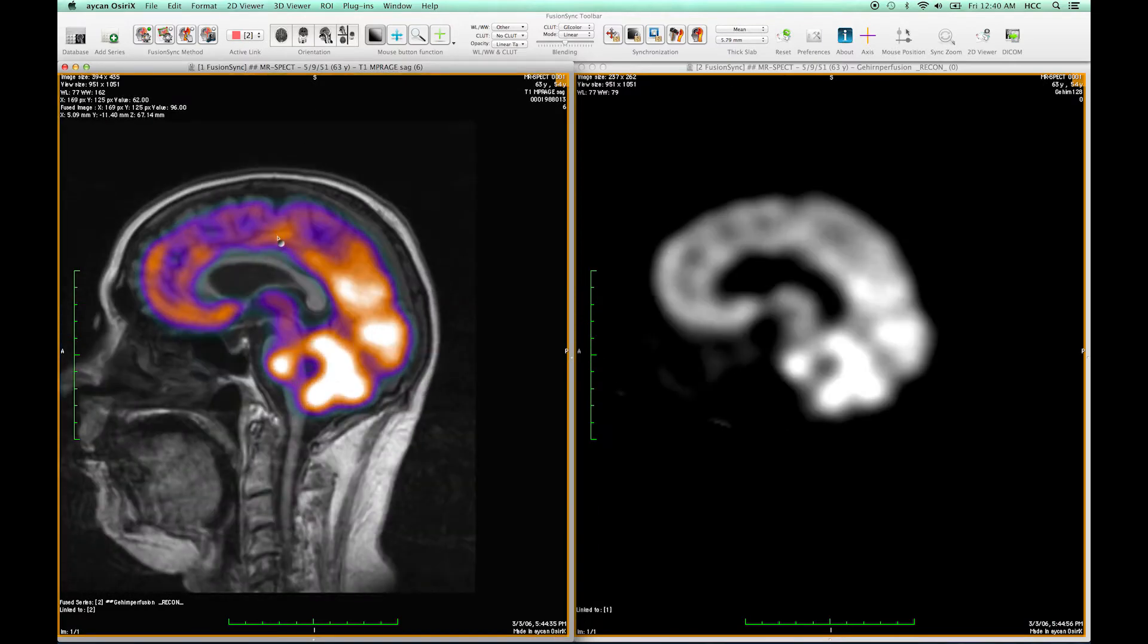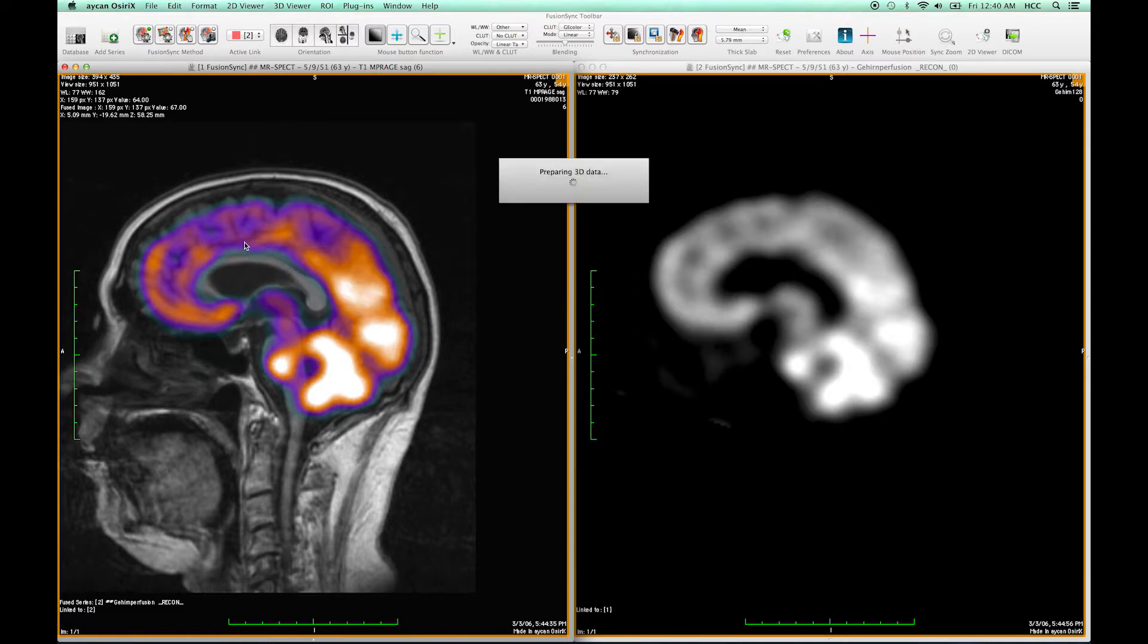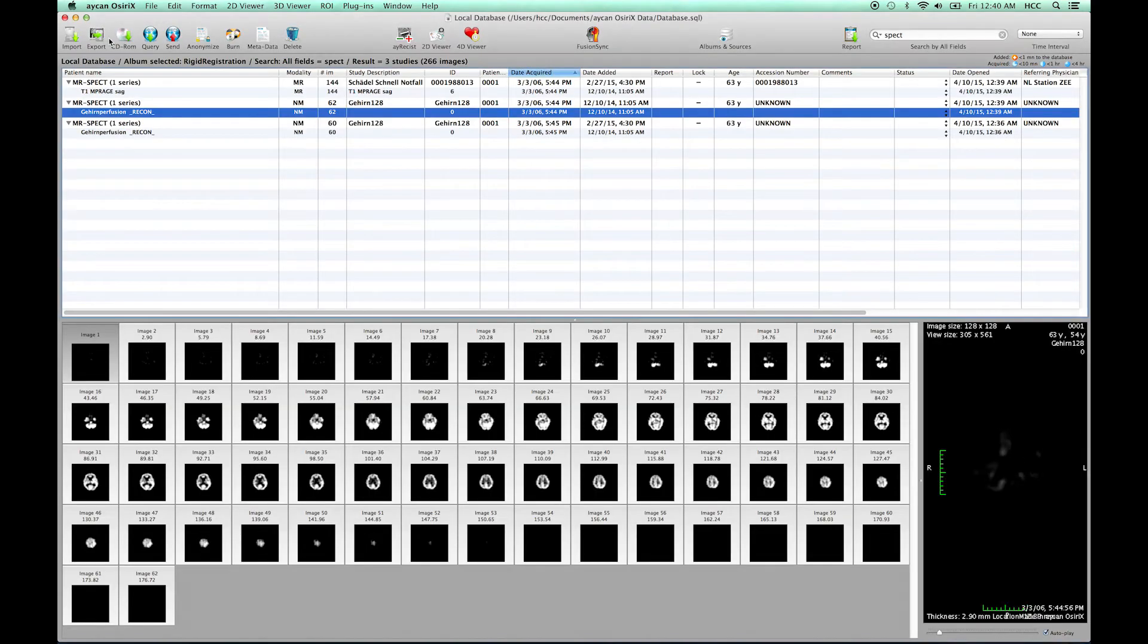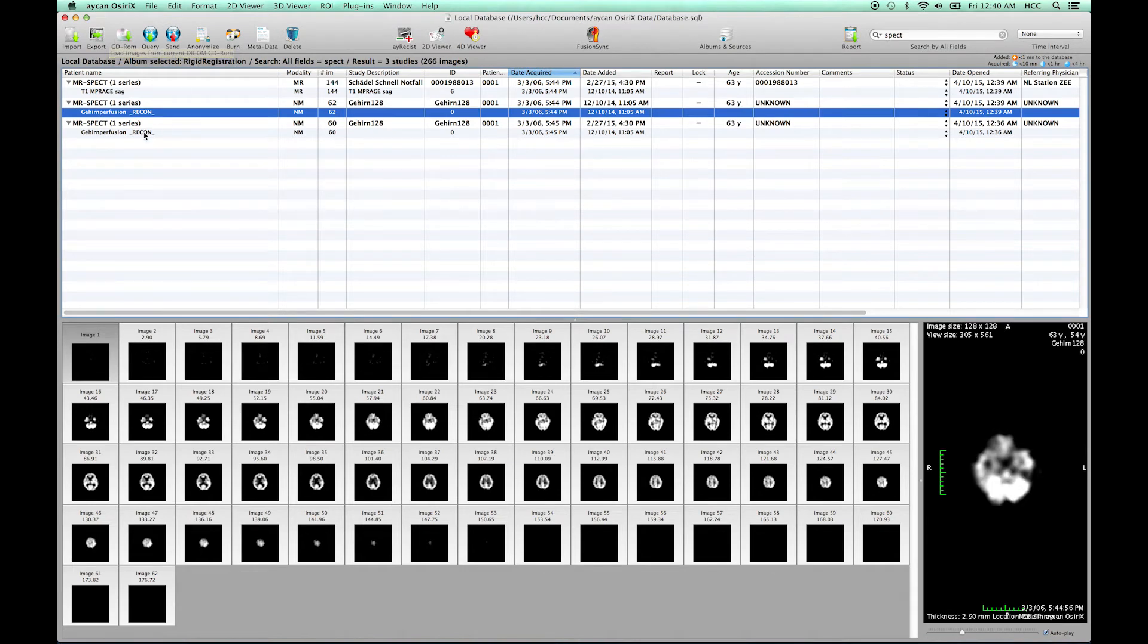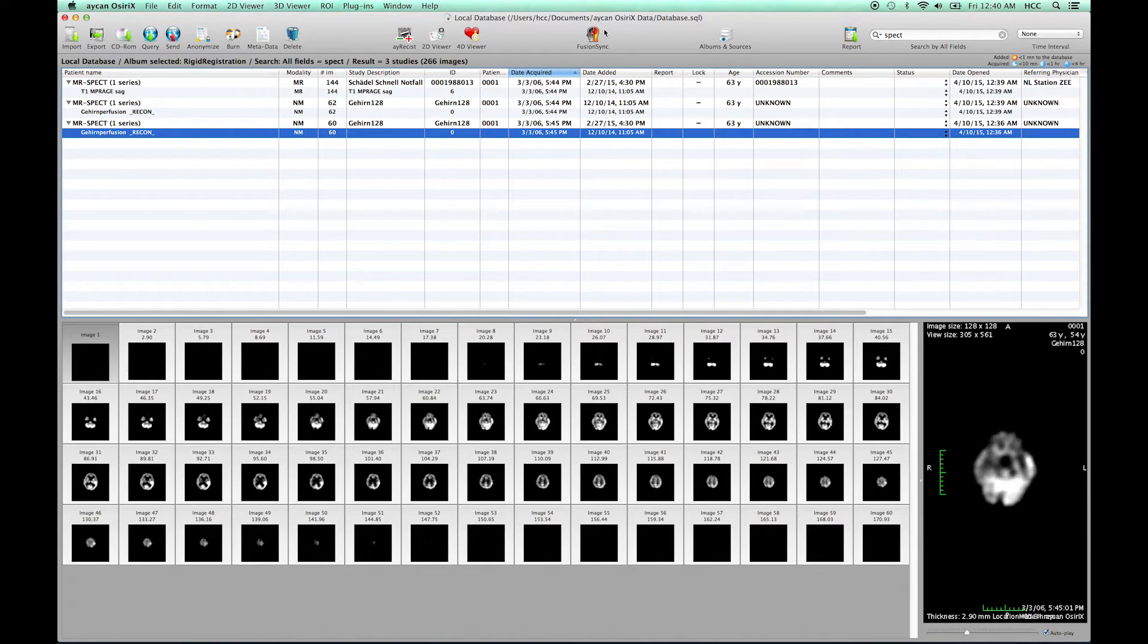Then we can add the second SPECT image to FusionSync by clicking the add series button which takes us right into the database browser. Here I select the second SPECT and press again FusionSync.